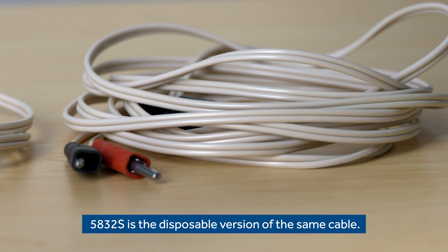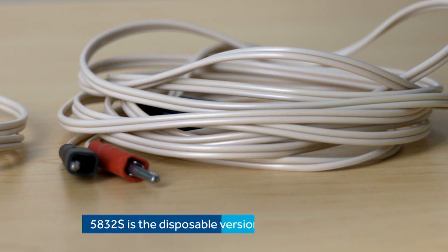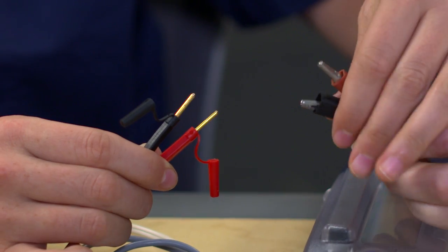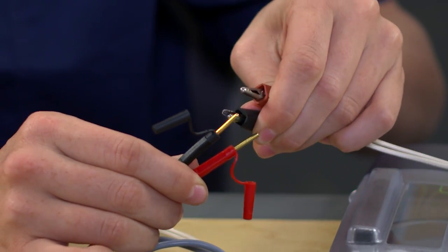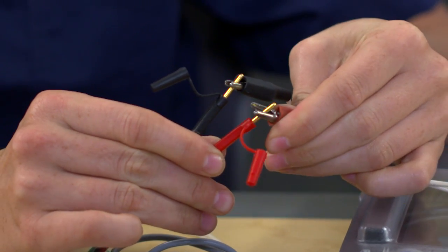One more cable to cover today is the 5832S. This one has alligator clips and is typically used during surgery — these clips attach onto the lead. Black connects to the negative pin and red to the positive, consistent with the color convention of the other cables. So now we've covered all the cables which are frequently used with temporary pacemakers. I hope that was helpful — thank you so much.